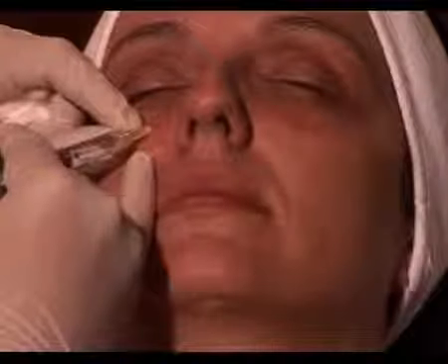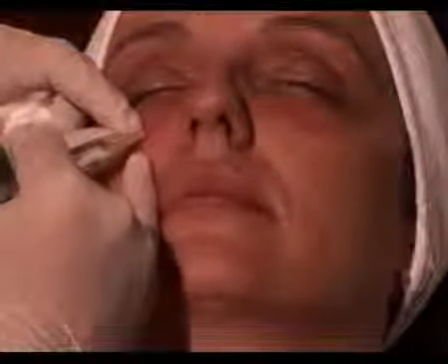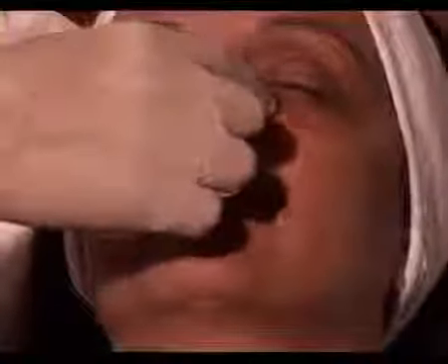Then you go a little bit medial to that. Also very deep, and you inject a small amount. I'm injecting 0.1 right now. Then you come out. And then you massage. Massaging is very, very important. The nice thing about this filler is that it does not swell. So it has a very low hygroscopicity, meaning that it won't absorb a lot of water. So it won't cause any major swelling.